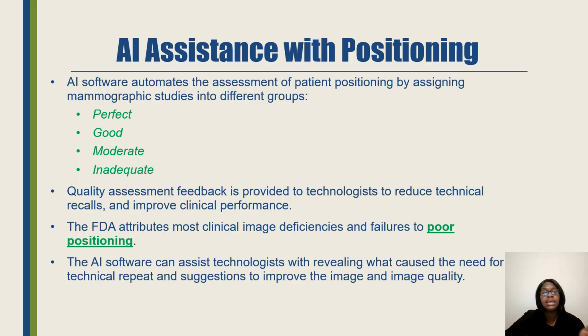Whenever AI is helping with positioning in radiology, it's going to flag whichever images have poor positioning, which image needs to be improved, which image needs better image quality. It's going to help reduce the need for repeat images from the technologists. It's also helpful in preventing patients from having to come back in. Sometimes patients live far, so it's going to help prevent them from coming back in.